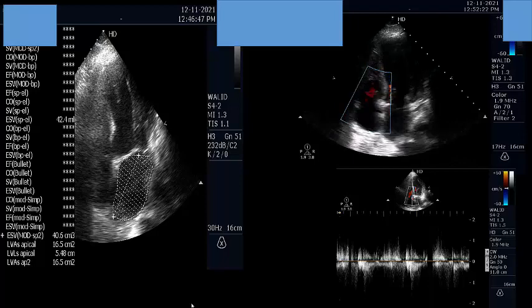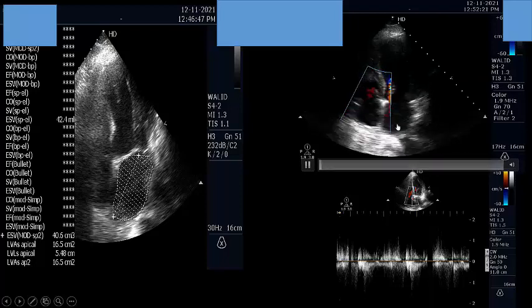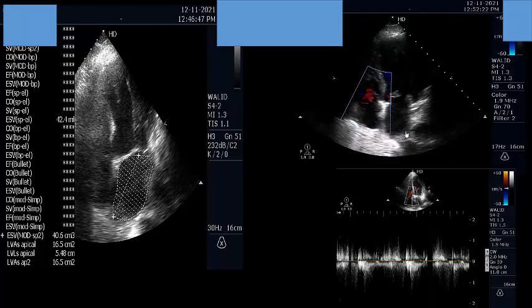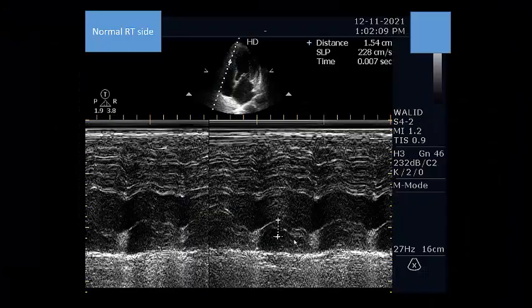So, does it explain the severe hypoxia due to acute cardiogenic pulmonary edema? Imagine a patient whose presumed diagnosis is acute cardiogenic pulmonary edema, and O2 saturation is 95 on 100% FiO2. So, could this small left atrium, with normal pressure, lead to back pressure in the pulmonary arterioles and cause florid pulmonary edema with this low pressure and low size and grade 1 diastolic dysfunction? My opinion, no. And the TAPSE is slightly decreased.